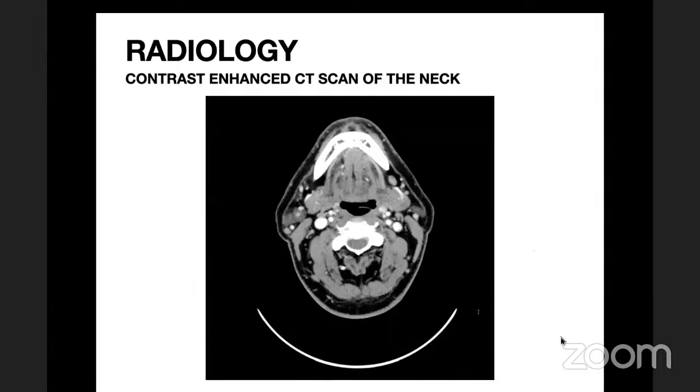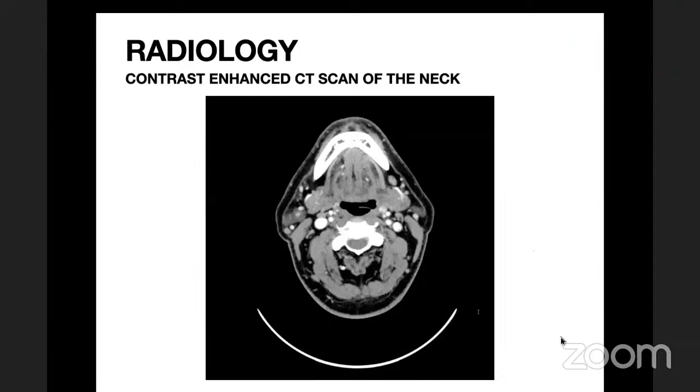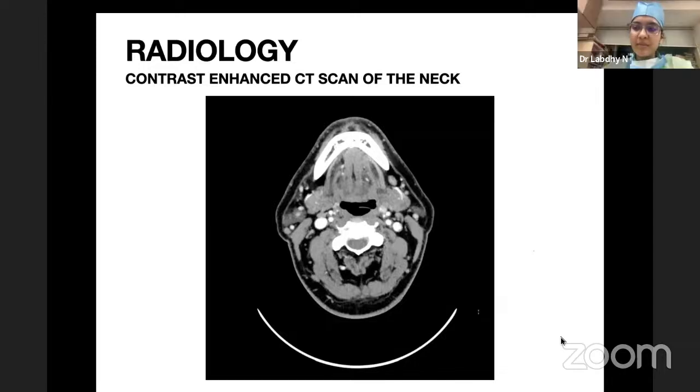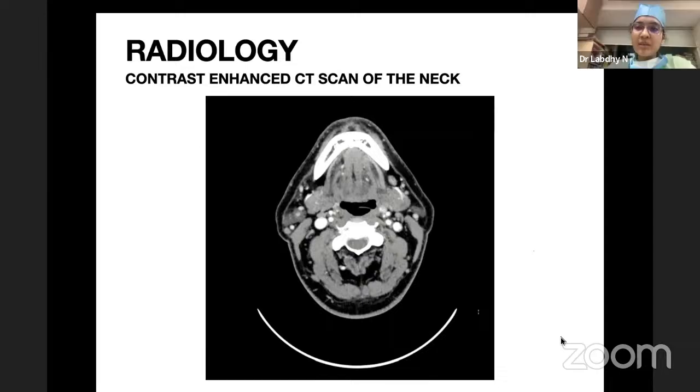So you want to do a tracheoesophageal puncture. What all material will you order? Sir, a grade 2 Provox tracheoesophageal prosthesis. What dimensions will you think about? Usually we use an 8 mm, 17 French prosthesis.